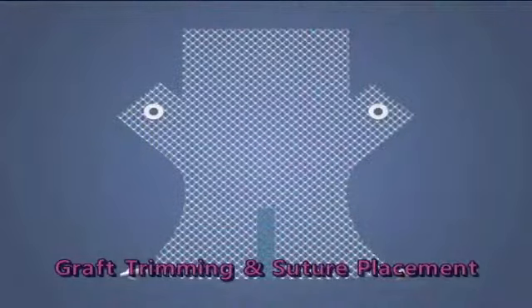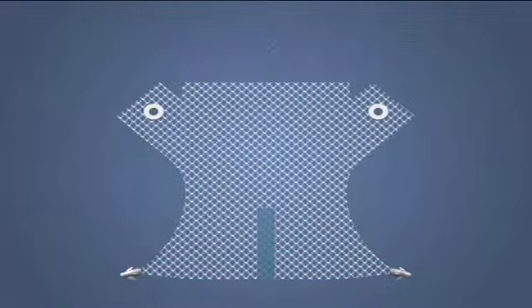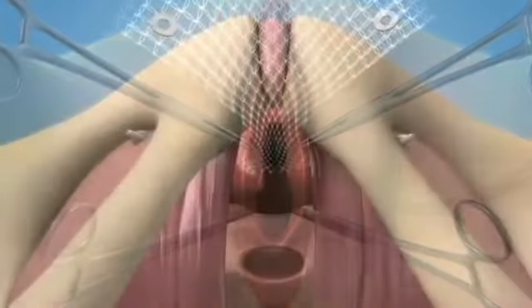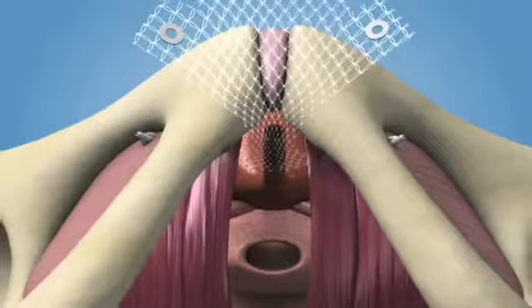Graft trimming and suture placement. Trim the apical end of the body to the desired length based on the patient's anatomy. Place 2 or more delayed absorbable sutures at the vaginal apex for later attachment to the graft.